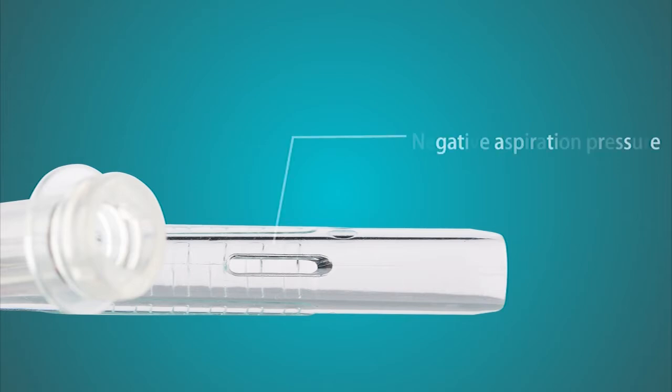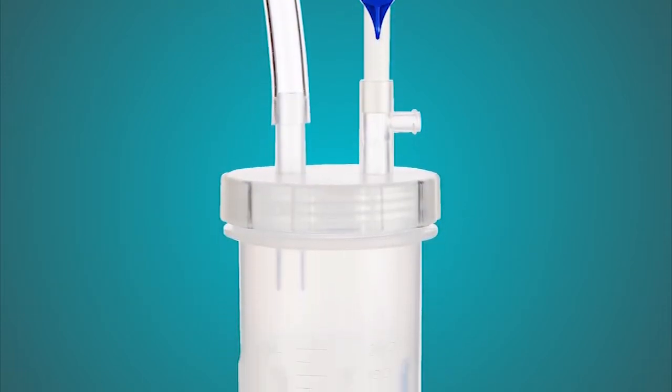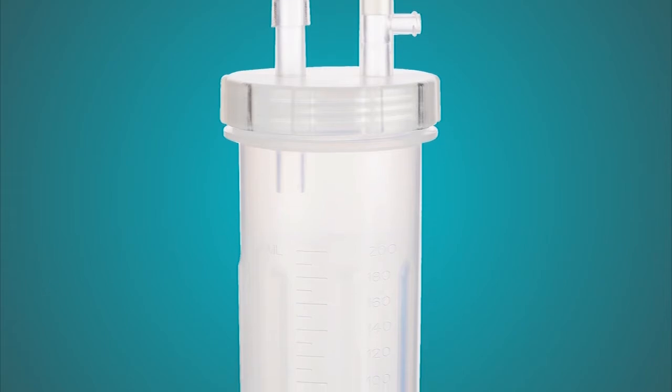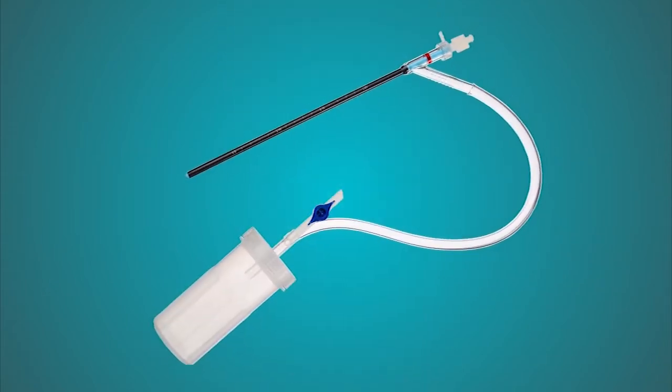The negative aspiration pressure can be adjusted using the pressure vent on the oblique branch. The collection bottle is used for collecting the stone fragments. The bottle can be sent directly to the laboratory.